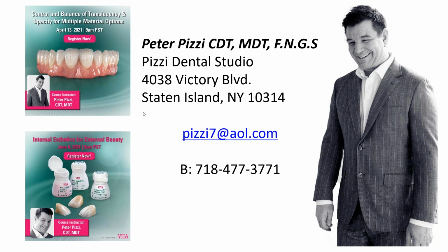Well, two ways. One, you might need to be more aggressive with the surface typography to start with, knowing that when I make a little ridge or a groove, if I make it very thin and I put a few microns over it, I'm not going to see the ridge. So maybe the goal is to make the ridge deeper. This way, as I'm painting my glaze on, I get more of that internal convexity or concavity that I'm looking for.